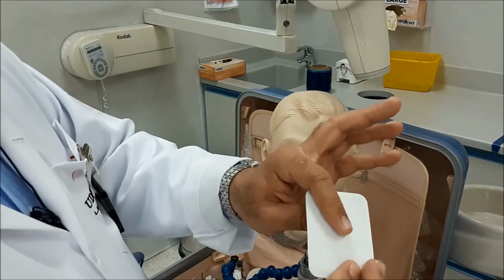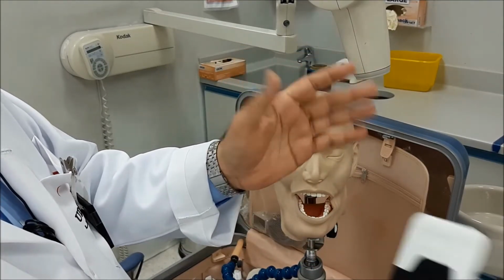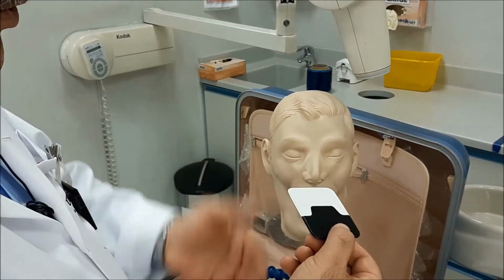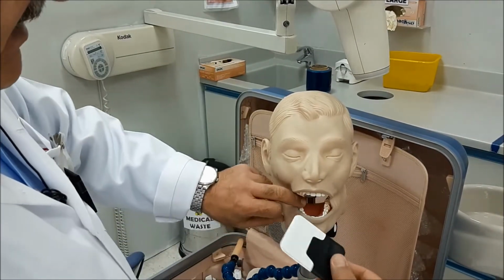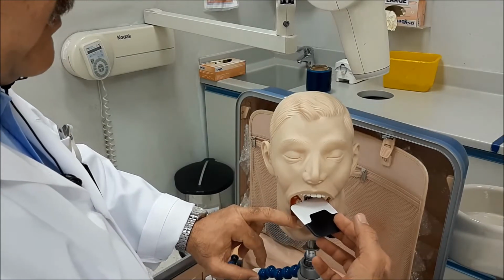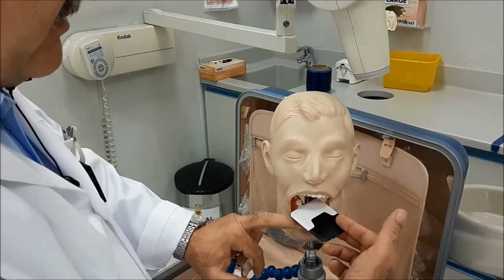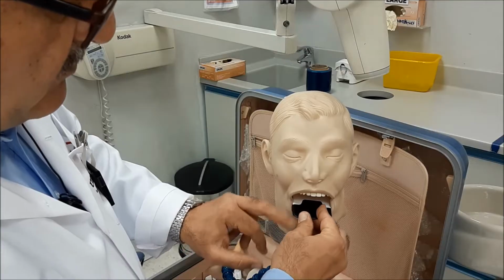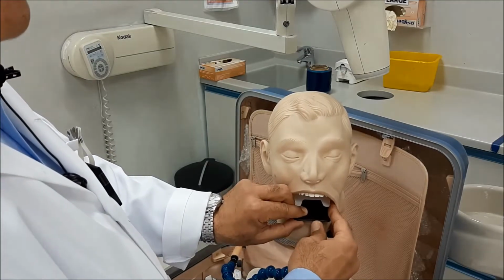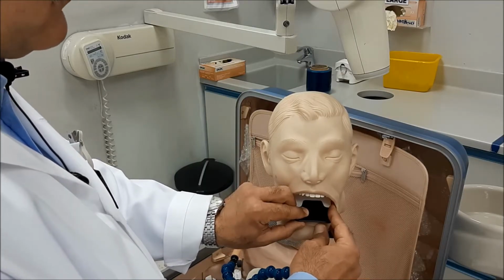Here, this is the exposure side of the film, and this is the back side of the film, this is general for all films. What you do is that you flip your film so that it points down, okay? And then you introduce your film inside the oral cavity, see, oblique, inside the oral cavity, rotate, and push it all the way back, so that you guarantee the largest coverage of the mandible or the maxilla.